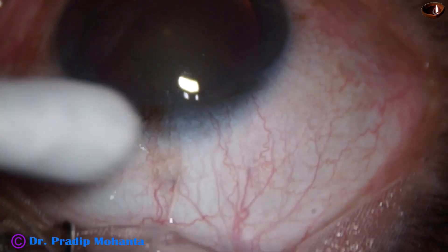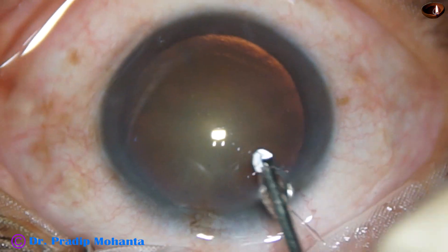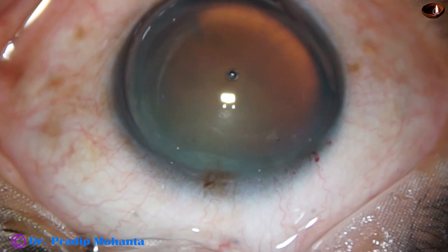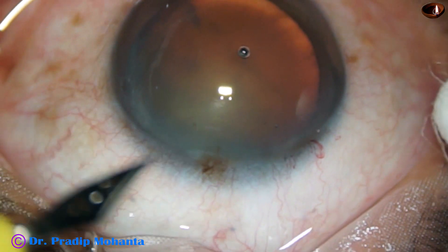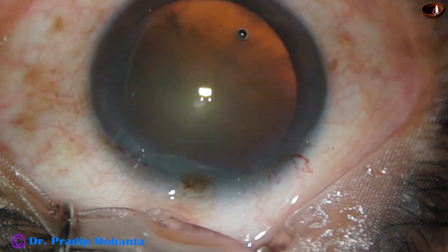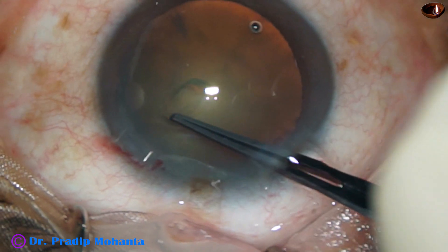We have started the surgery. The main incision has been placed at around 11 o'clock. Visco is injected to fill out the anterior chamber and applied over the corneal epithelium — this is 2% HPMC. Now one side port is being made on the left side of the main incision, about 2.5 clock hours away. In this case, I have done only one side port. Now capsulorhexis.